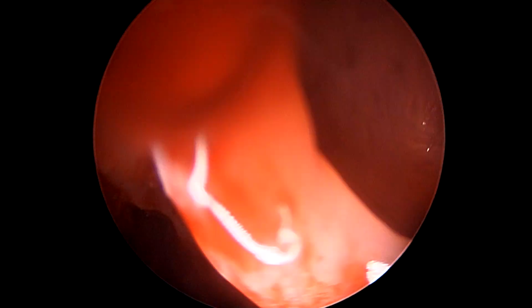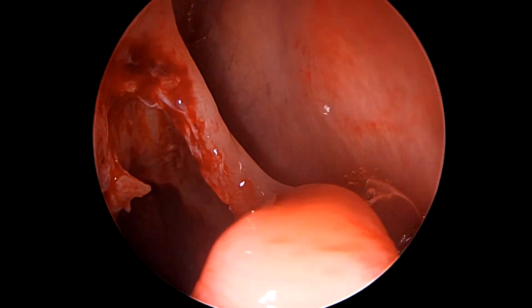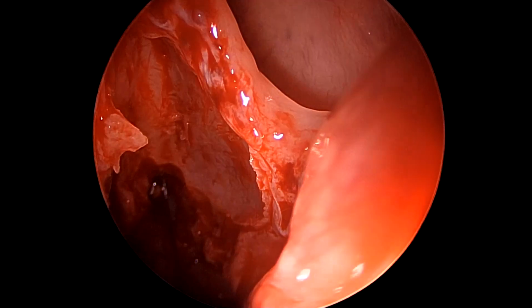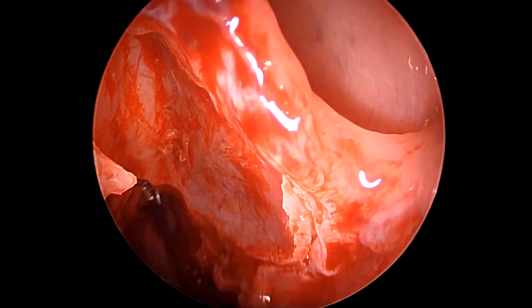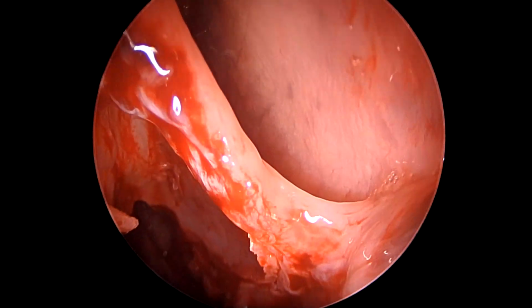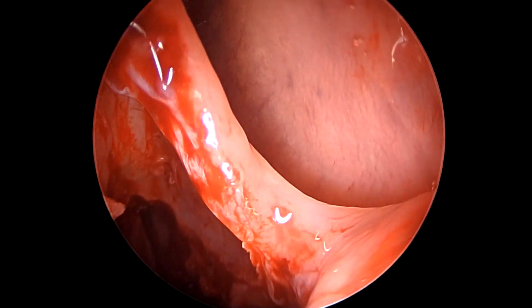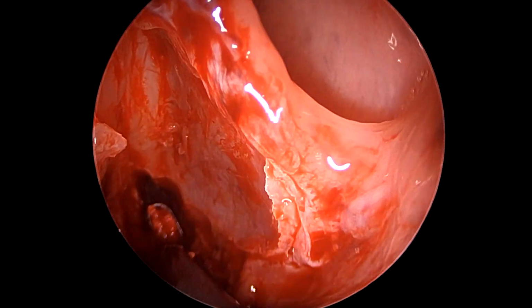As we see here, we are still removing the biting of the frontal beak slightly more to give us a larger entry inside the frontal sinus, because part of the fragment of that T3 cell is still not completely removed. And you will shortly see that as we remove some more bone, we'll be getting a more comfortable entry inside the frontal sinus for sure. And the large T3 cell would not impede us then.